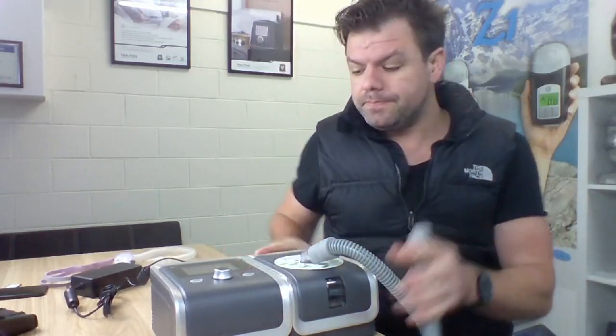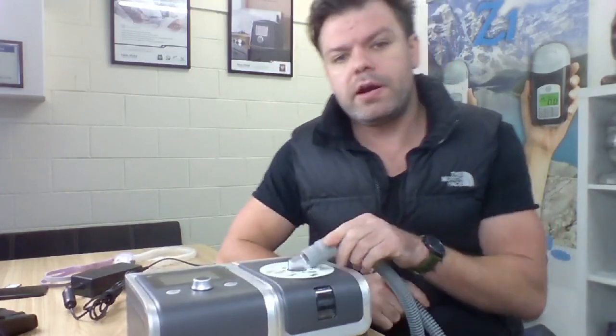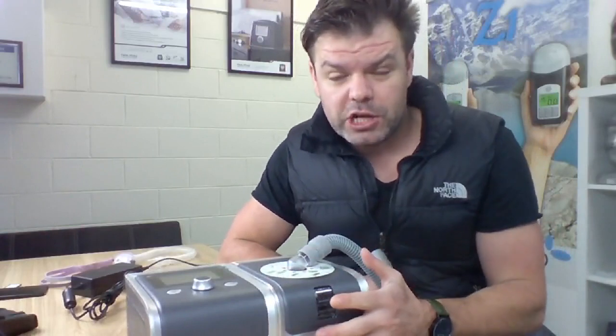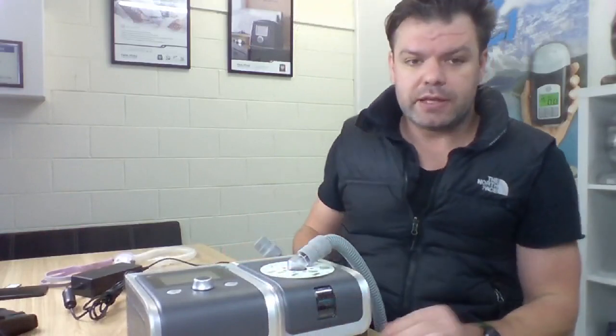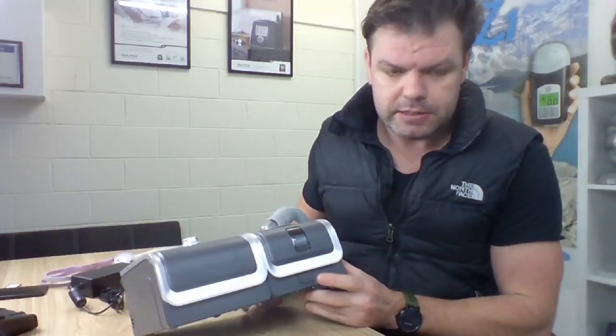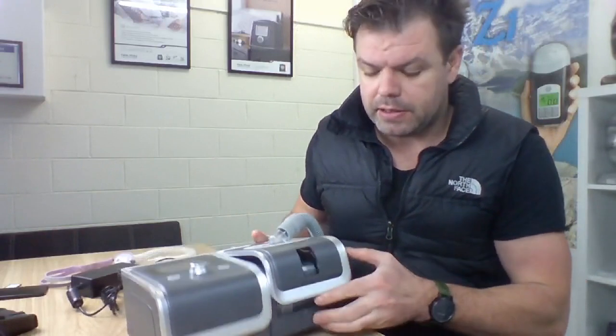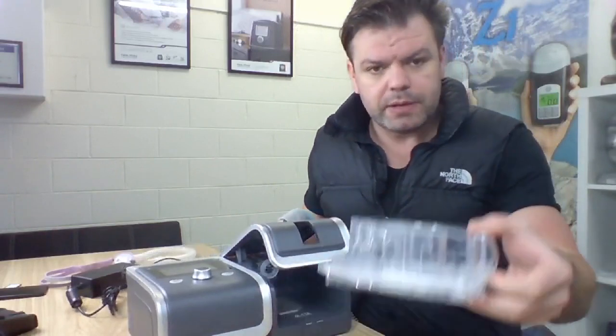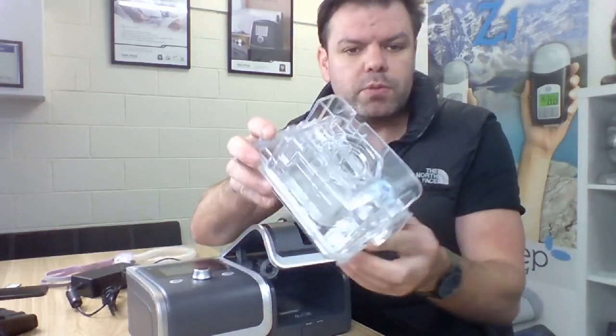Once we've got the tubing on, the next step before operating is to fill up what they call the H60 humidifier chamber. To do that, there's a little button on the front just here. If we press that button, the lid pops up, and we can pull out our little chamber. So this is our water chamber here.